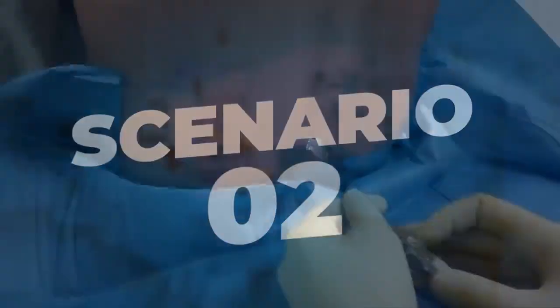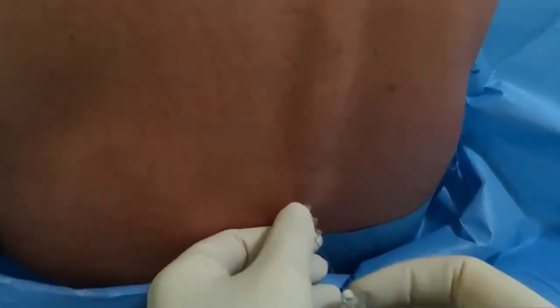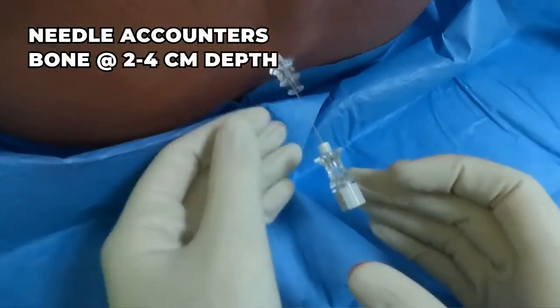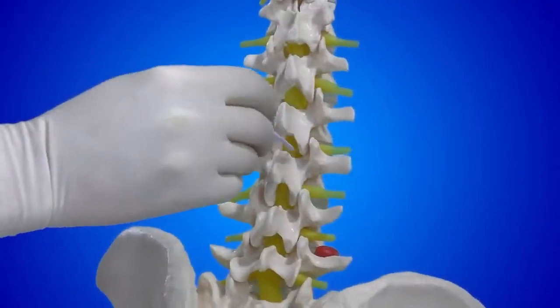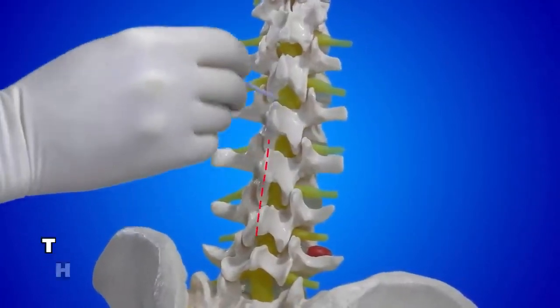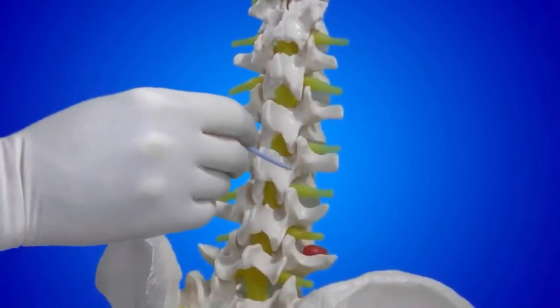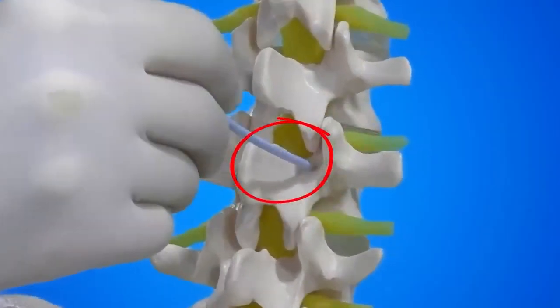Scenario number 2, the needle enters and touches the bone deeper at about 2 to 4 centimeters deeper. What that really means is that we are not in the midline, rather that we are paramedial one side or the other, and the needle is now touching the lamina.